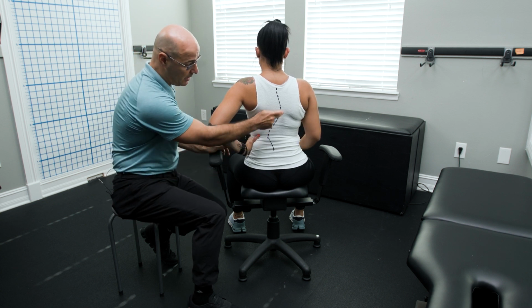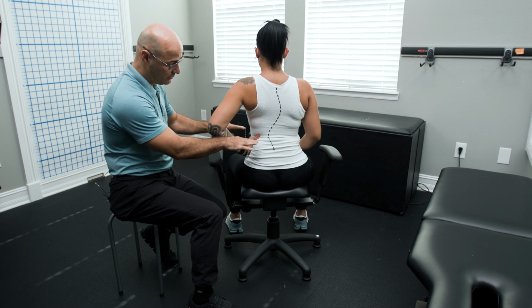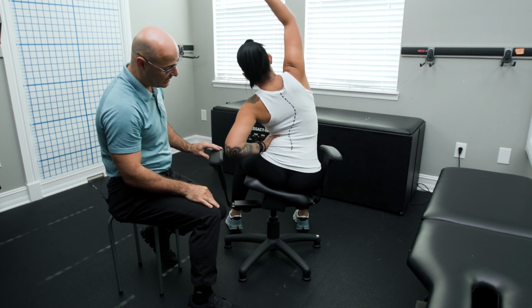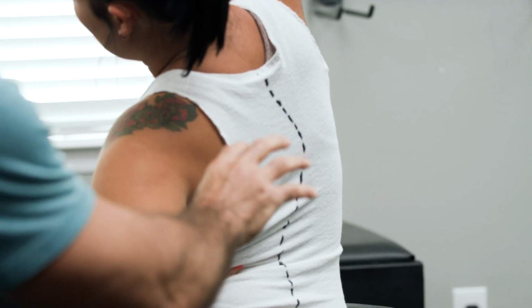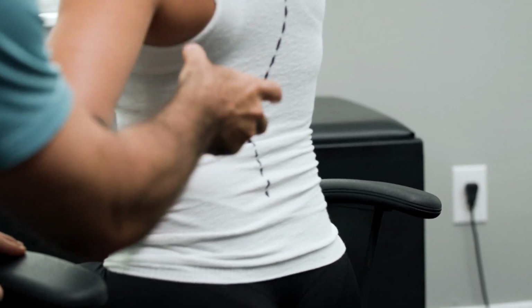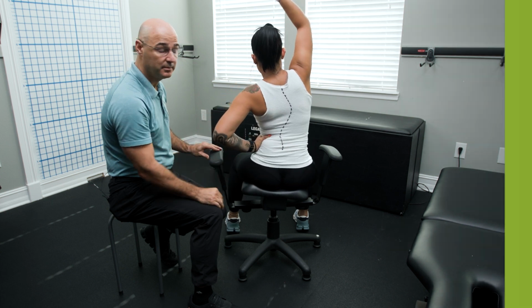We'll be working on the lumbar and the thoracic curve at the apex. So we find where the apex is and we instruct the patient to use their hand as a pivot, and then they're going to flex over that curve. So go ahead and do that for me. And when they flex, they're going to use their hand to kind of push into that curve to help unwedge those discs that have occurred into the scoliosis pattern. And what this is doing is helping mobilize and warm up these disc tissues so when we perform our future therapy, we have a better response.